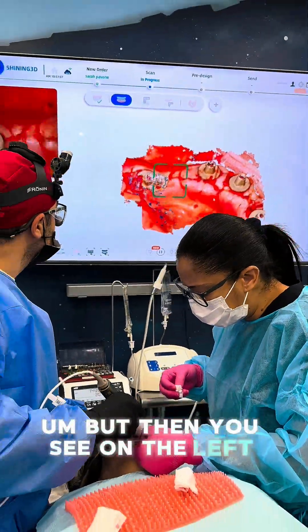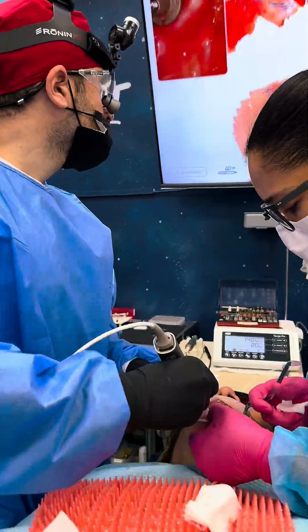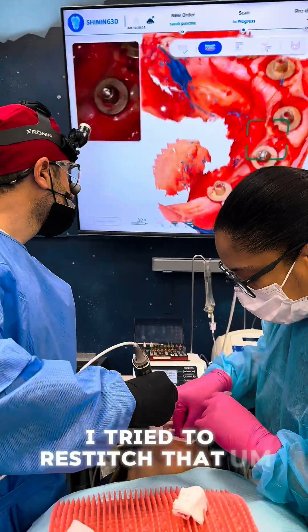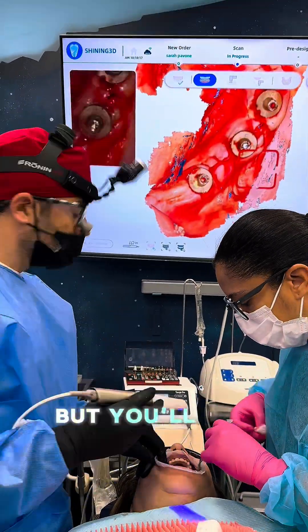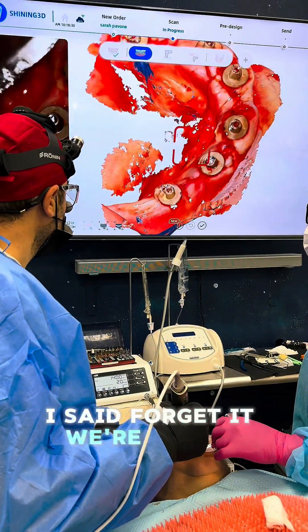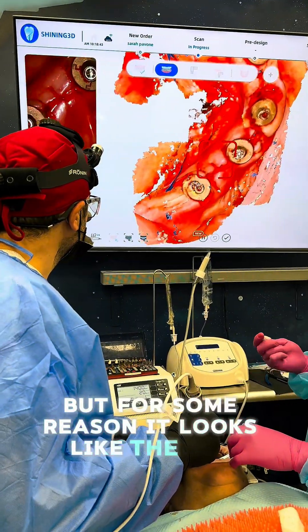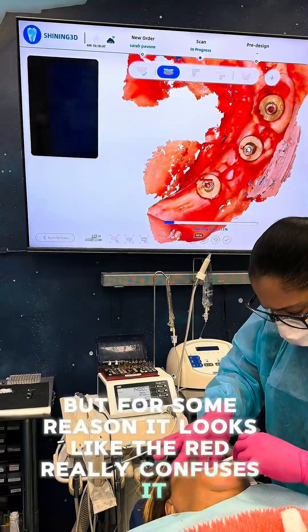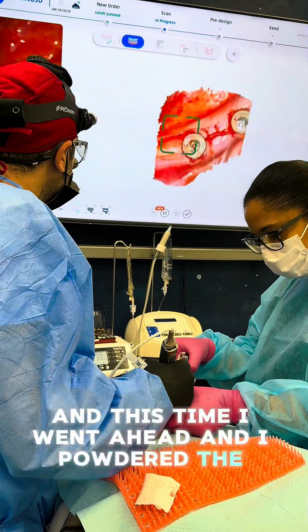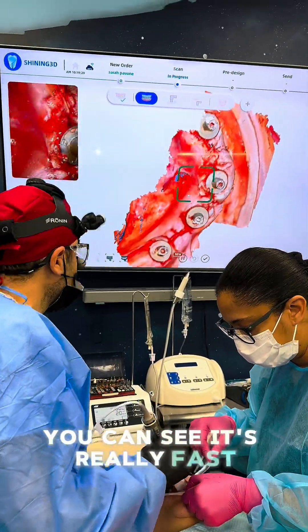On the left-hand side it gets a little bit confused. I tried to restitch that, but we started to get a double scan on one side. I said forget it - we're going to completely abandon it. Even though there's not much blood, the red really seems to confuse it. So I deleted the scan and this time went ahead and powdered the arch, which is part of my flow, and you can see it picks up really fast.